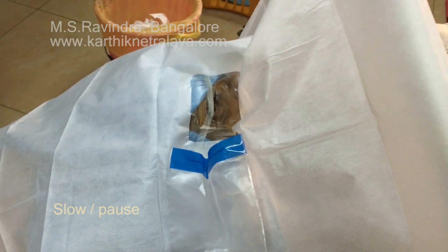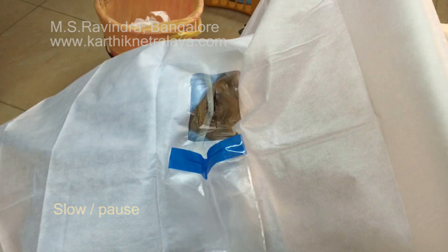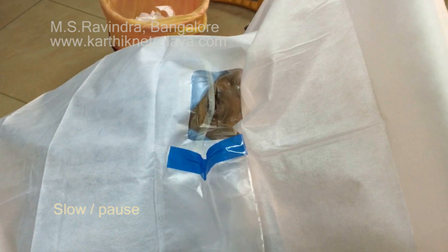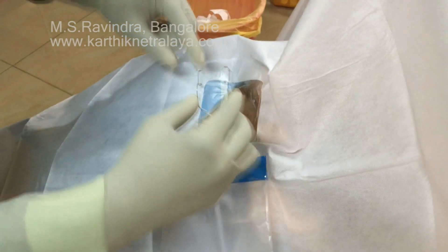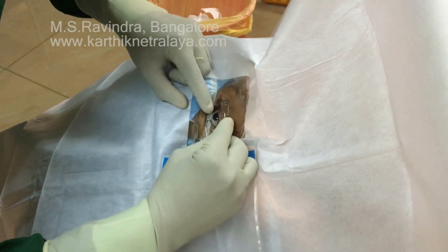Sometimes the slit in the drape does not correspond with the lid aperture. Ideally it should be at the junction of the lower one-third and upper two-thirds of the palpable aperture, and sometimes the drape is bridged across the medial canthus to the nose. If that happens and proper draping is not achieved, you have to release from the nose and reapply it after placing a finger on the right side of the bridge of the nose.